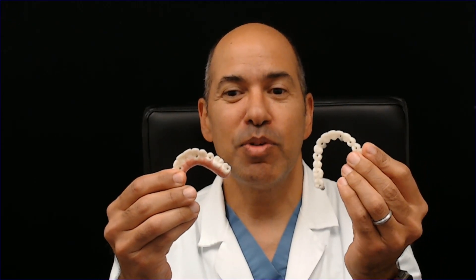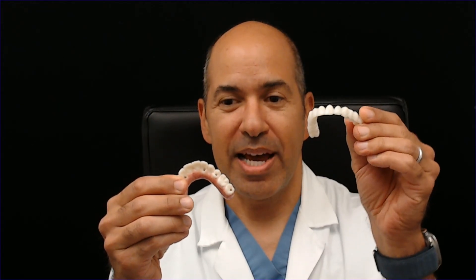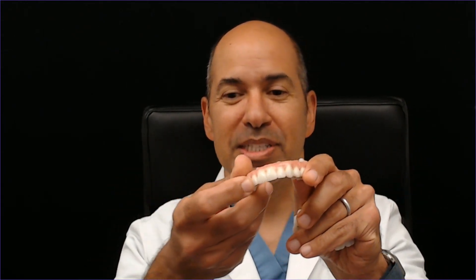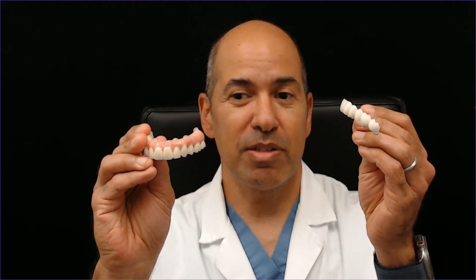There's a lot of confusion for when we replace all teeth, whether we have a bridge like this that has just implants, or whether we have a bridge like this that has teeth, gums, bone, connected to the implants. Let's go through the differences between the two.